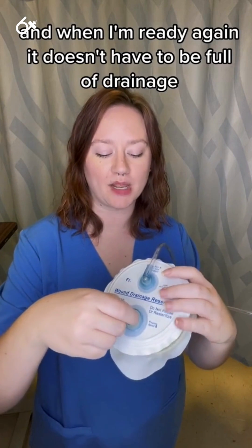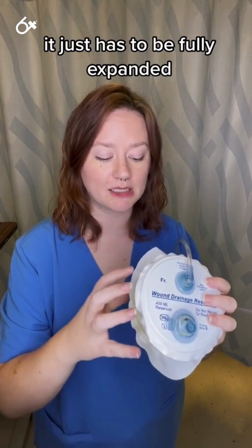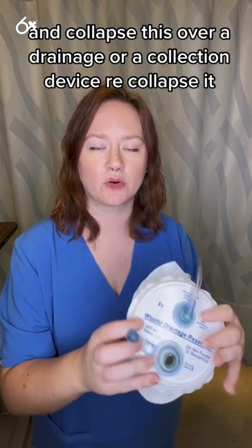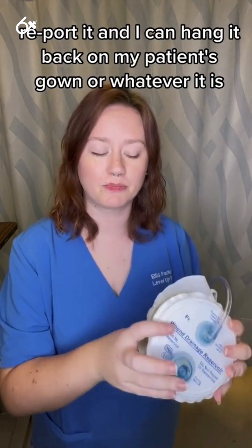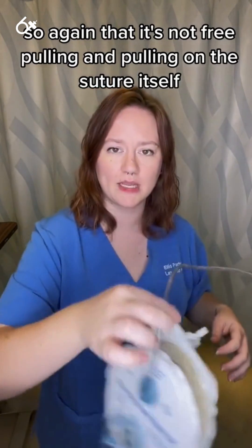When I'm ready, it doesn't have to be full of drainage — it just has to be fully expanded for me to remove the port with gloves on and collapse this over a drainage or collection device, re-collapse it, re-port it, and I can hang it back on my patient's gown. That is not free pulling and pulling on the suture itself.